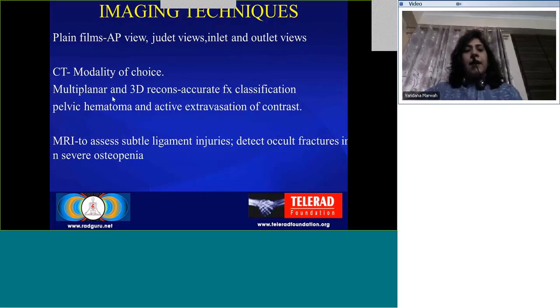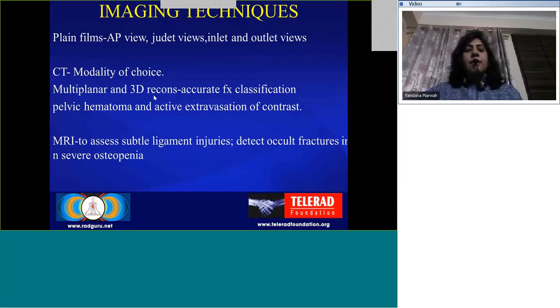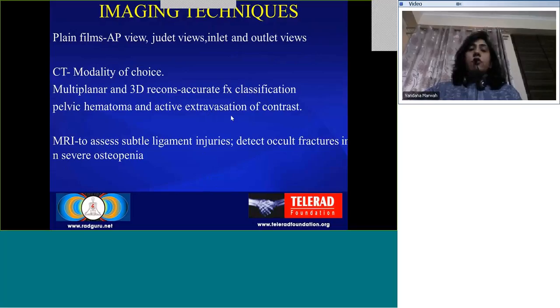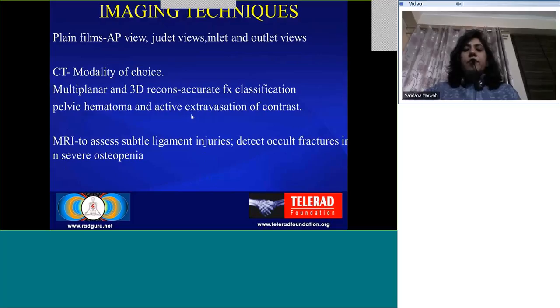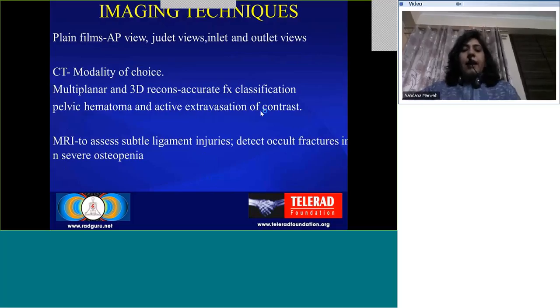With multiplanar and 3D reconstructions, we can accurately identify all the fractures, even the joints. The additional advantage, of course, is we can detect pelvic hematomas, any active extravasation to detect active hemorrhage, and of course the organs — urinary bladder, etc.